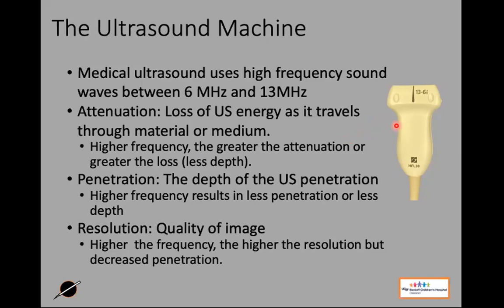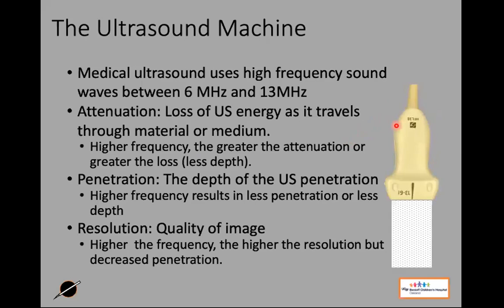Okay. I'm going to flip this probe over here, and I'm going to show you our sound waves kind of travel away from our probe, just like that. Okay, they're traveling through. And as the sound wave travels through the tissue, things are sent back to that probe. We process those images into things we see on our ultrasound screen.